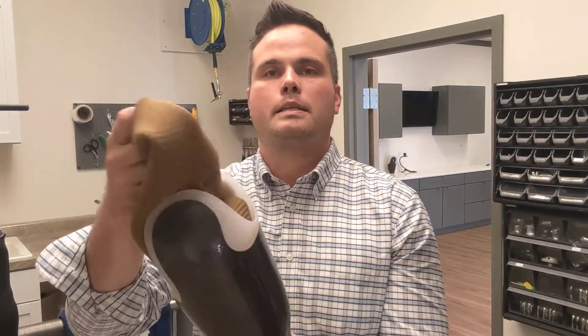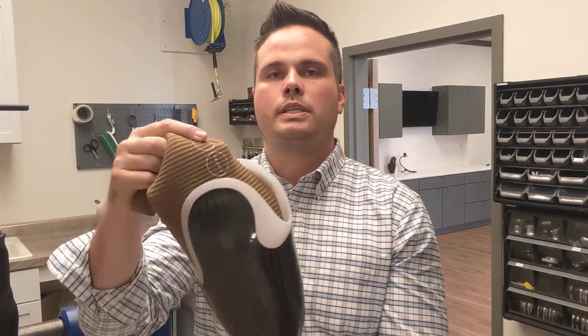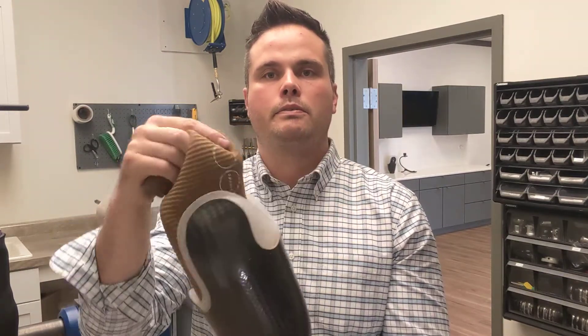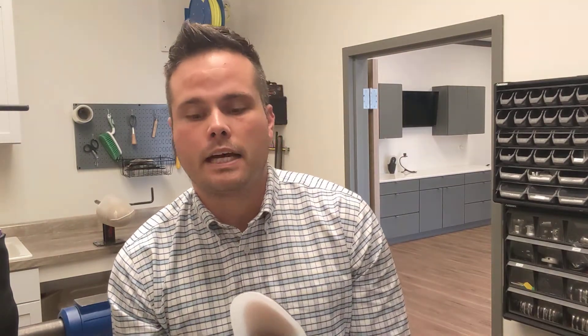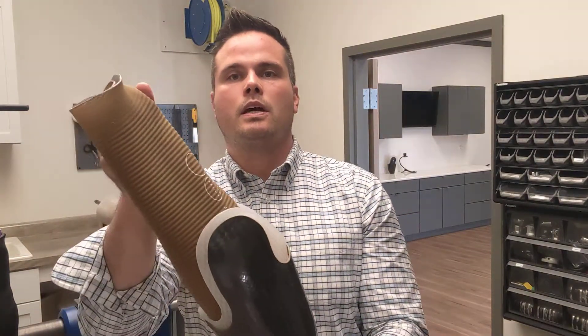The advantage is that the patient has maximum range of motion at the knee — you can picture the knee moving back and forth pretty much uninhibited. The disadvantage is more so the stretch or elongation that you get with walking. As the patient walks, the weight of the prosthesis and gravity can have a tendency to distract the prosthesis downward, making it feel a little less connected. That's the pin locking system.